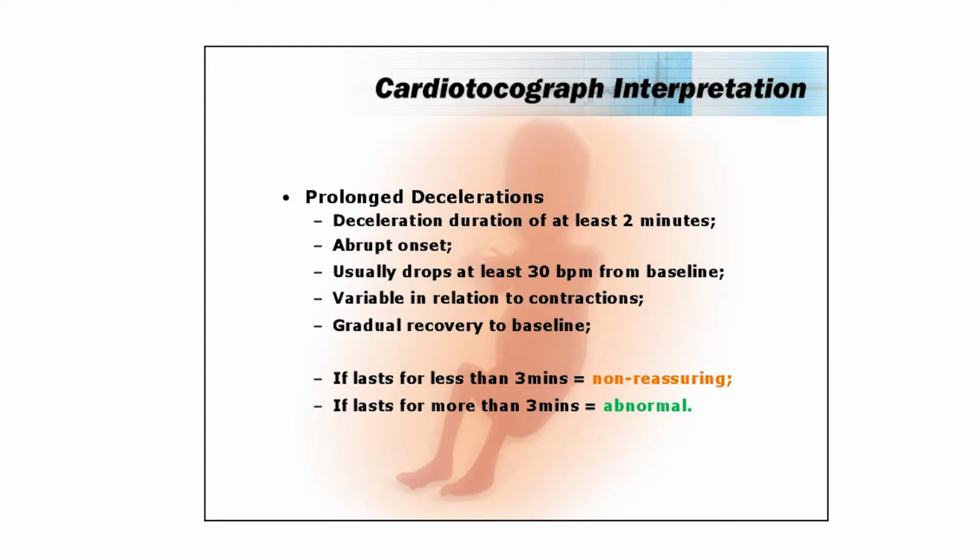Someone said there? It's 10. 10 minutes, which sounds like a long time. But a deceleration lasting 2 to 10 minutes is technically a prolonged deceleration. And after 10 minutes, it's a bradycardia. I am not saying that you treat those any differently. 8 minutes or 11 minutes, you're not going to be treating them any differently. You're still going to be concerned at that point in time. But in terms of the technicality of the language, a prolonged deceleration is 2 to 10 minutes.